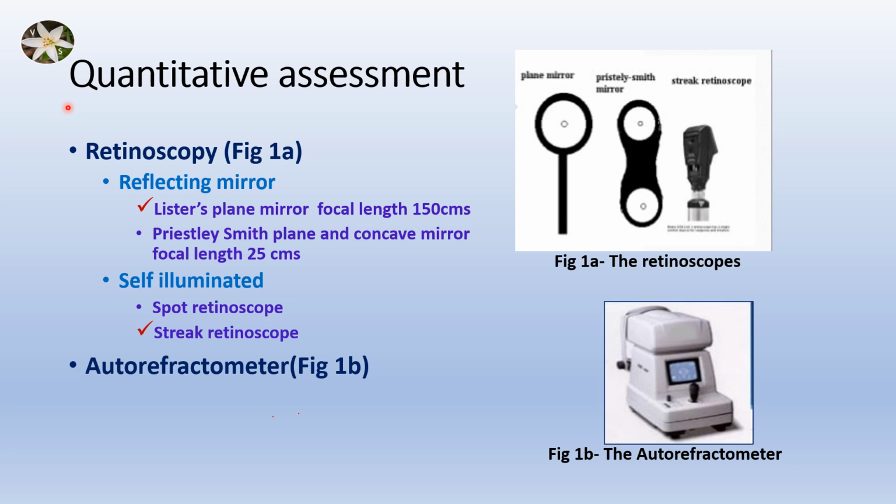We cannot proceed to manage a refractive error without a quantitative assessment. This can be done by retinoscopy or by an autorefractometer. The autorefractometer has made the process of assessing refractive error quantitatively quicker.